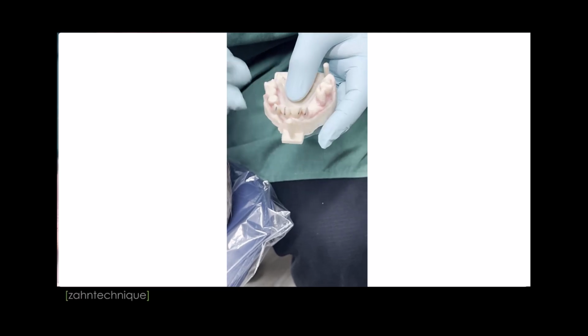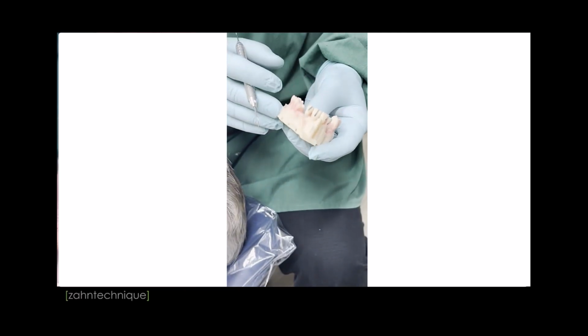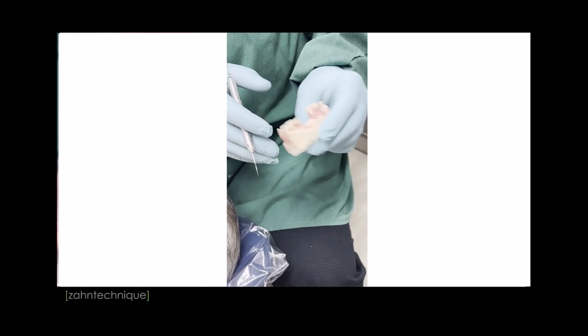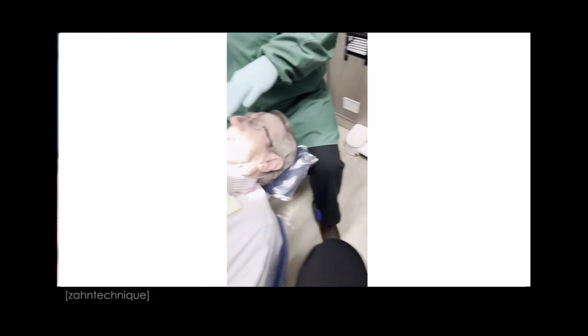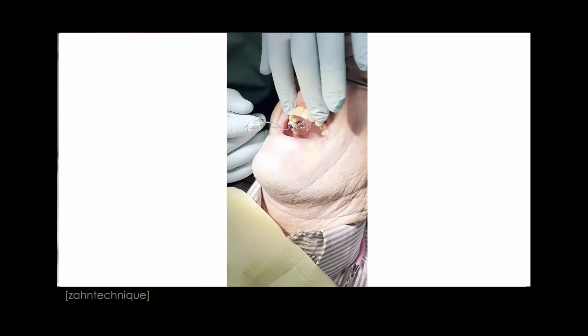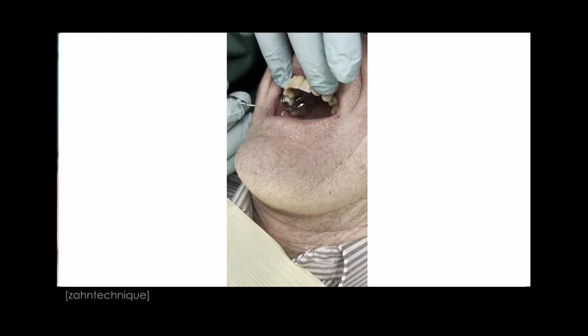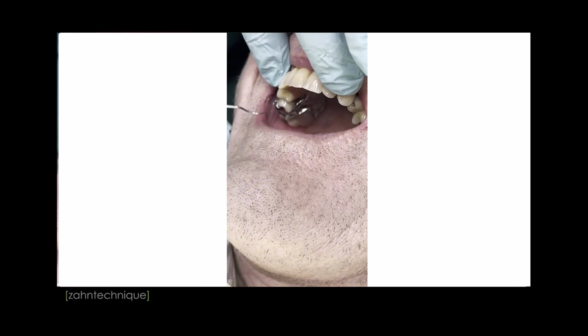If we do an upper partial over a palate, with a big palatal strap, we have to imagine soft tissue compression, right? So there is maybe a change possible. So maybe we want to do a wash impression in the pickup and then rescan that to actually fabricate the partial.